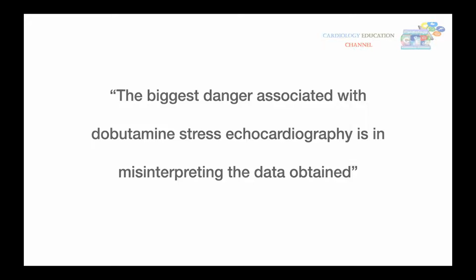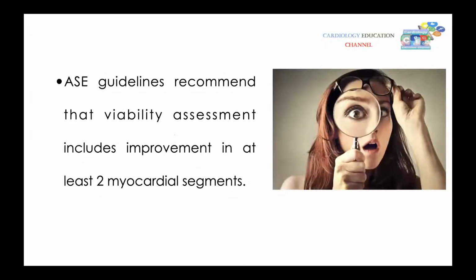The American Society of Echocardiography recommends that viability assessment include improvement of at least 2 myocardial segments in the same vascular territory. So to say this is a viable vascular territory, you should have improvement in 2 or more myocardial segments in the same vascular territory.